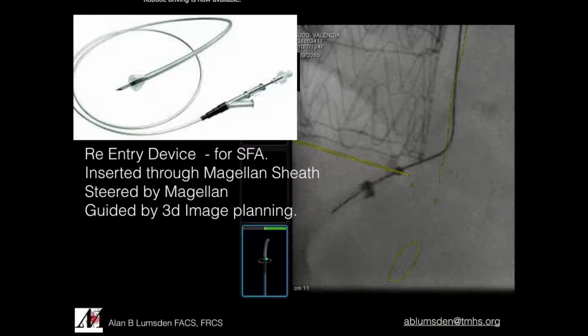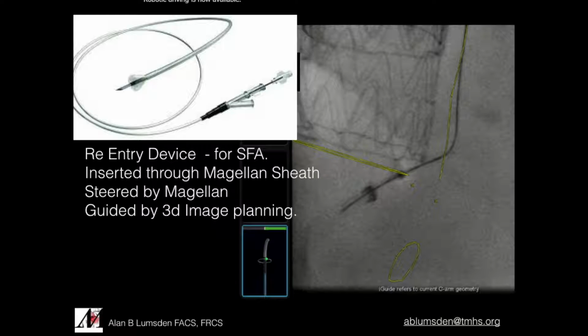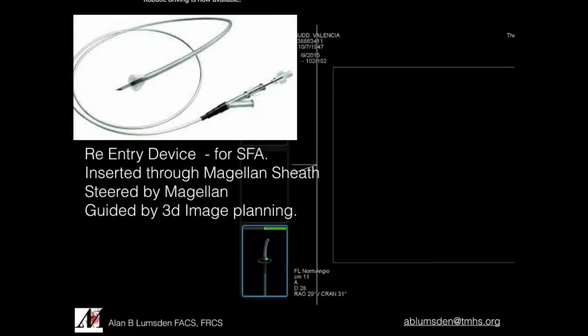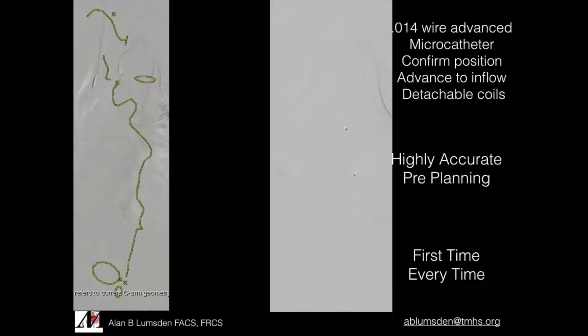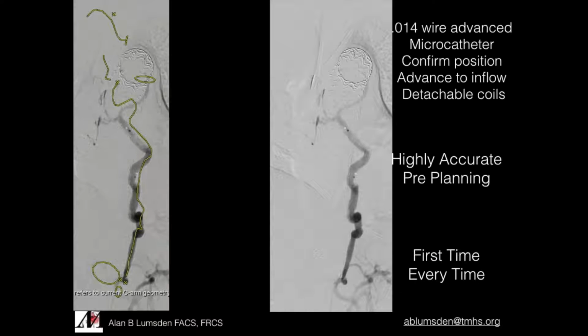We then advanced a needle, which was perforated through the septum. This is a balloon which supports the needle. The needle has a 4 millimeter throw, and you can see it coming right at the bottom of the endograft. When you advance the wire, it goes straight up and into the endoleak pathway. And you can see the wire is actually passing up this predetermined pathway, which we'd also marked and overlaid. Once you do that, you can put a catheter up in it, and you can inject. It almost looks like an artery, which is formed inside the false lumen.